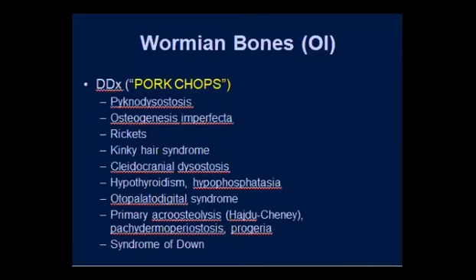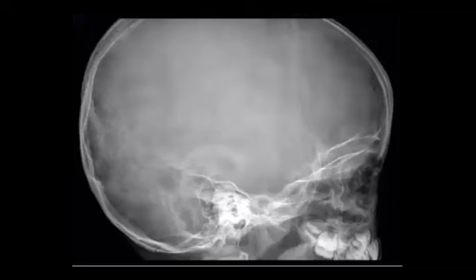Normal number of wormian bones is 8 to 10. Above 10 is abnormal. Thank you. So normally it's from 8 to 10, and above 10 it will be abnormal, right? You mean this for the wormian bones? Okay. Thank you.